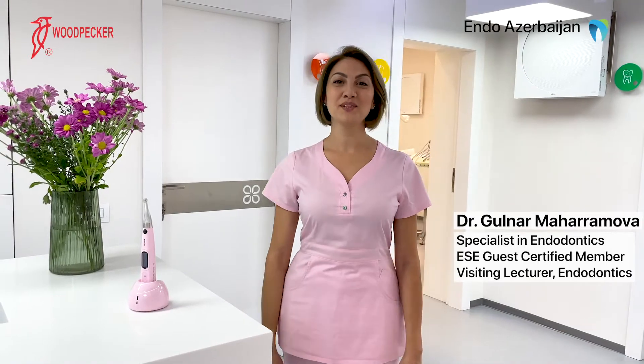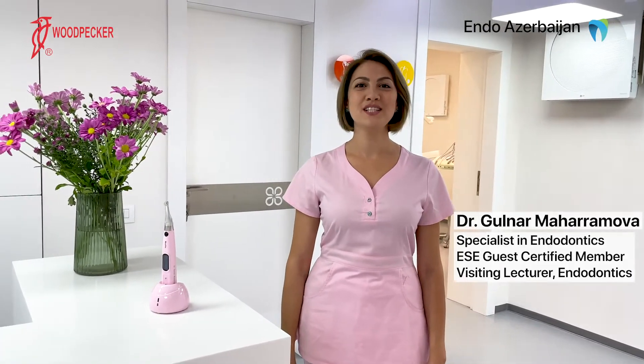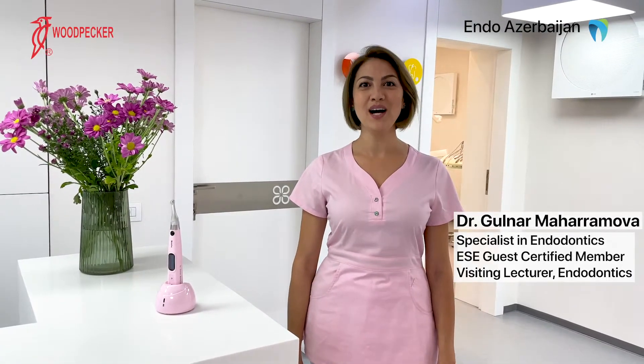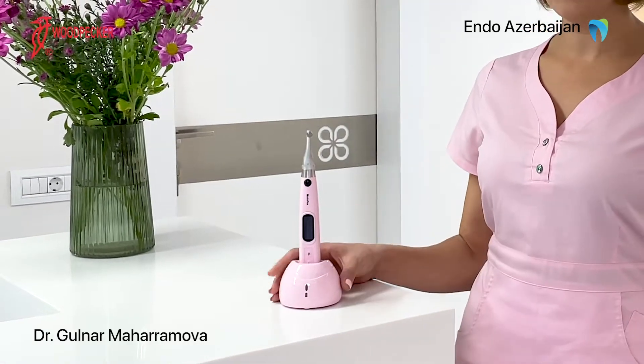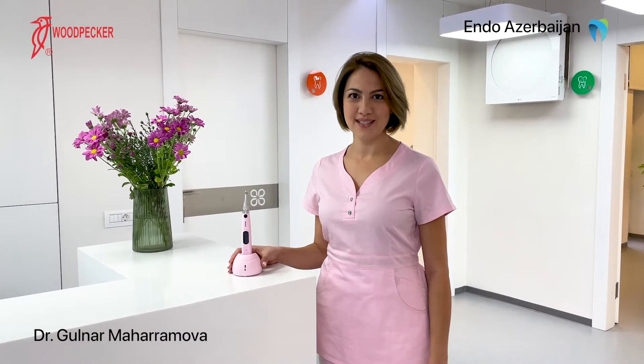Good day everyone. I'm Dr. Gylnar Maharamova, a specialist endodontist based in Baku, Azerbaijan. In today's video, I will be showing a case of using Woodpecker endomotor Motopex and how it helps me in my daily practice.